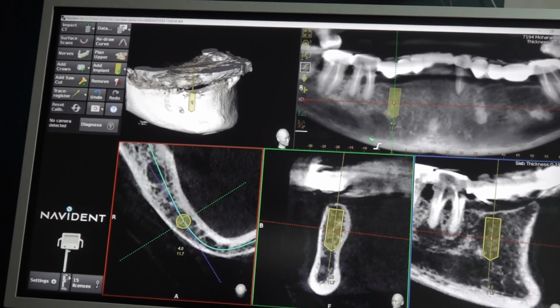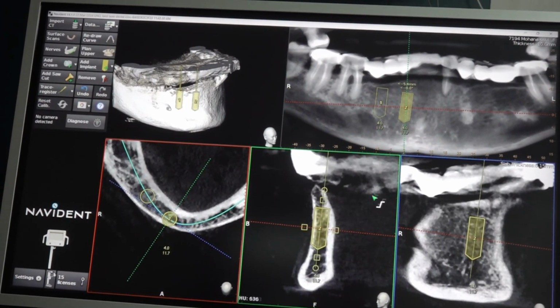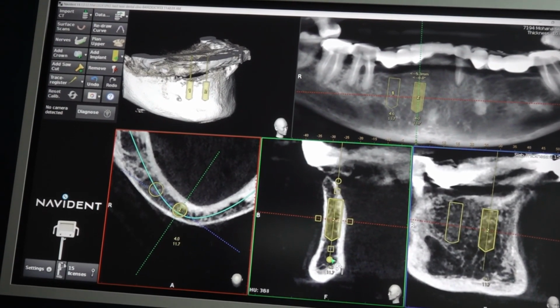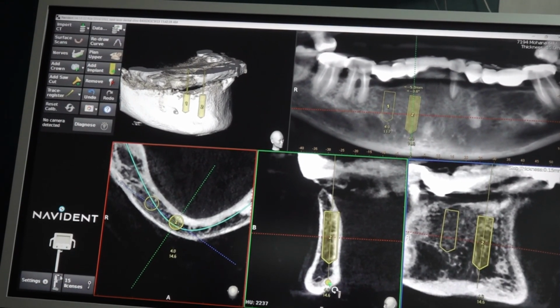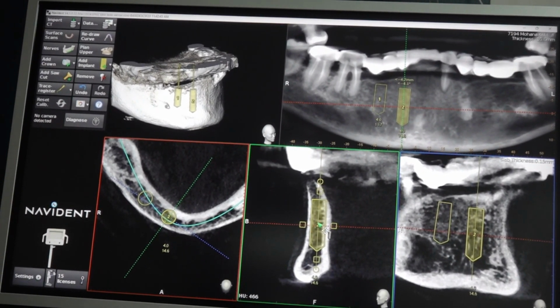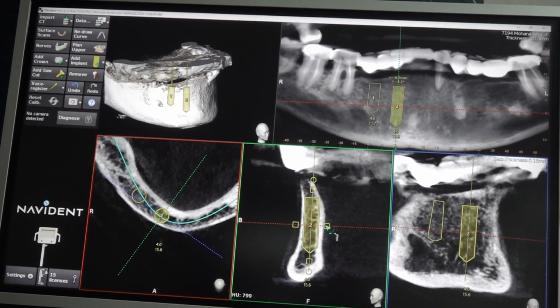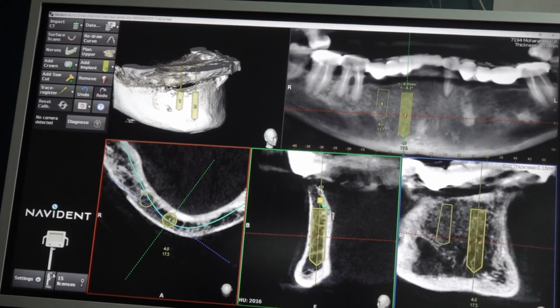So whenever you find osteoporotic bone, place all the implants straight, no tilting. If you tilt, then you have to bend the abutment, and it is not possible to bend the abutment, the implant body itself will move. So here a smaller diameter implant we need to place, right? 3 point something. Here the anatomy is good actually. And here we will be doing alveoloplasty, right?